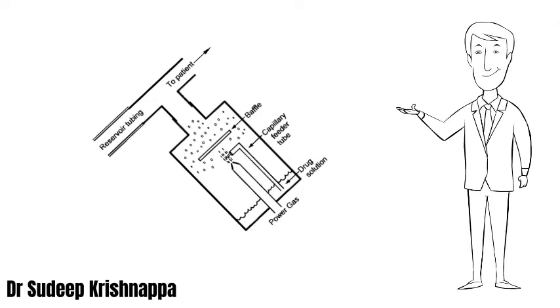If the chamber is not upright, as highlighted in the diagram here, the fluid in the chamber tends to gravitate down. If the lower end of the capillary tube or the cap is not in contact with the fluid, the siphoning effect of the fluid does not happen and therefore aerosolization does not happen. So this brings us to the point that the nebulization chamber has to be absolutely upright in order for this to function properly.